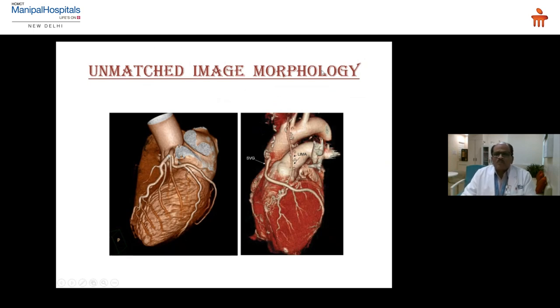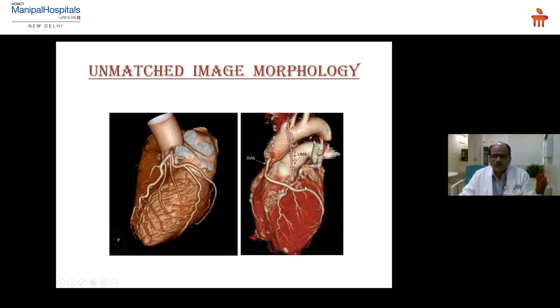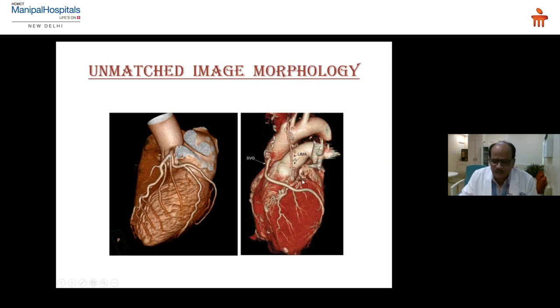This demonstrates the unmatched morphological detail possible with CT. You can see the detail of the coronary artery — the LAD, diagonal, ramus intermedius, LCX, and obtuse marginal. Regarding grafts, this shows SVG to OM and LIMA to LAD — graft evaluation is also excellent with CT scan.